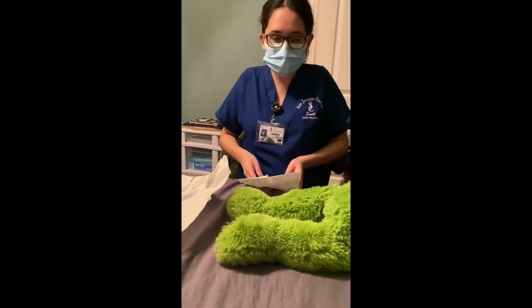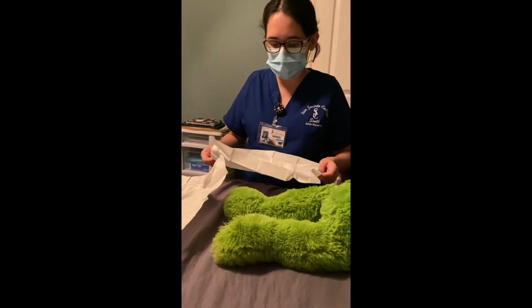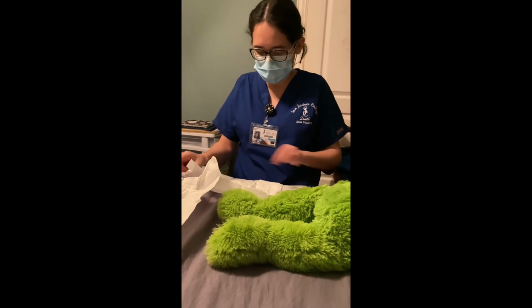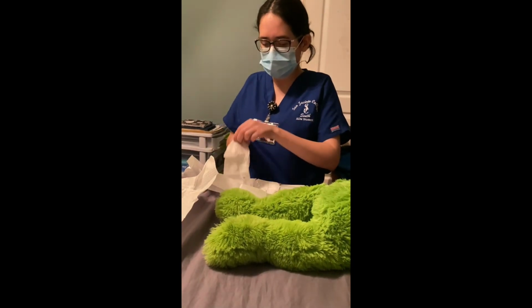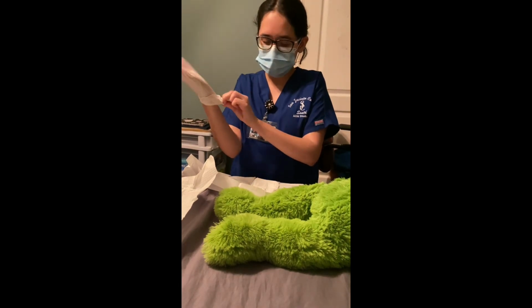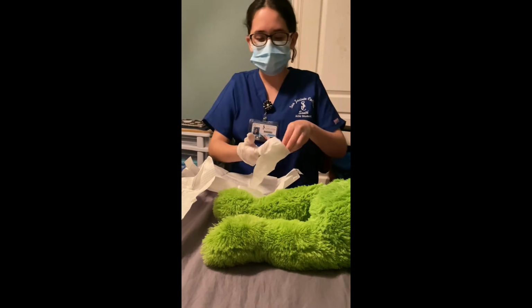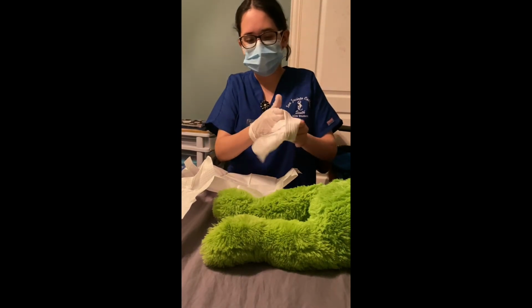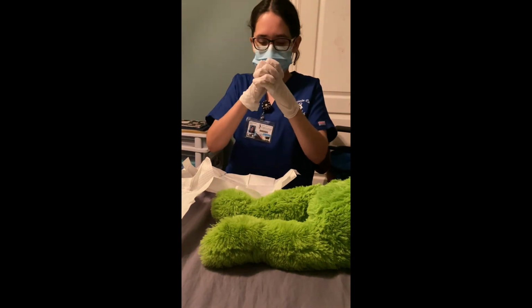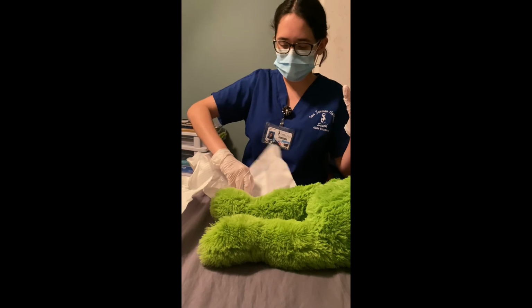Due to the circumstances, I'm here in a tight space, but usually in a hospital setting or somewhere else, I wouldn't have this problem. Okay, so I'm going to apply my sterile gloves on. Okay, so I'm still sterile. I'm going to grab this since it's sterile in here and throw that away.